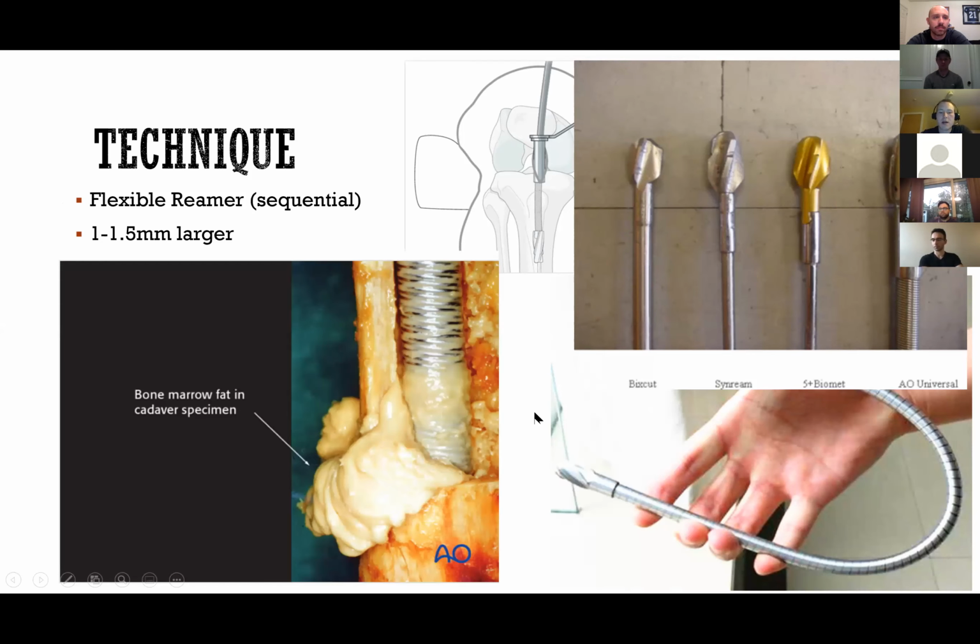This I put in to remind me to talk to you guys. One of the downsides of nailing, or the things that you need to be aware of, is a medullary embolus. It is possible when you're reaming a long bone that because of the pressure of shoving a stiff metal rod down the center of that canal, you may displace some of the marrow, and that can seep into the bloodstream, especially through ruptured blood vessels around the fracture, and then cause an embolus to the lungs.